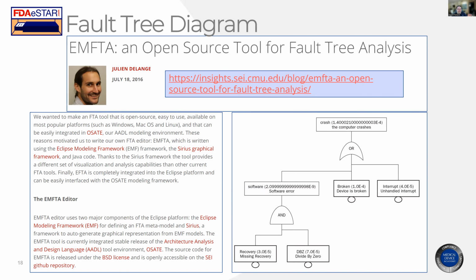So this way of pictorially showing the risks of your system and how it functions is extremely valuable, and they do it for a reason. So you might want to think about this tool. The other thing is the way this is structured is a top-down approach to risk management rather than a bottom-up approach. Your DFMEAs, your PFMEAs, your use FMEAs, those are all bottom-up.